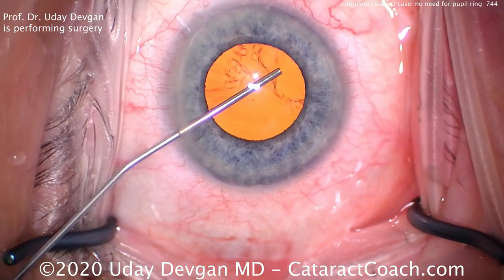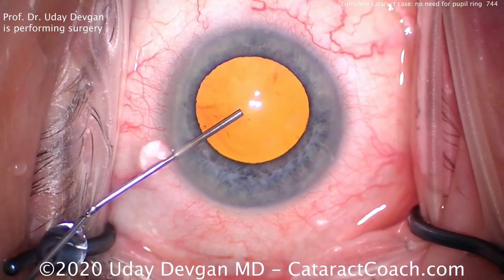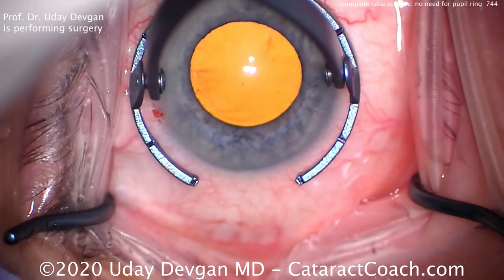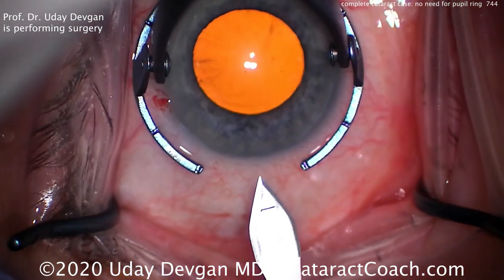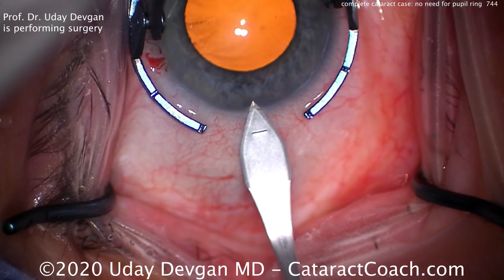So we put anesthetic inside the eye. Here's the viscoelastic. Notice how we can do some viscomidriasis with that dispersive viscoelastic, get the pupil a little larger. Now here it looks like a pretty reasonable pupil, but we know for sure in these patients the pupil's gonna come down.